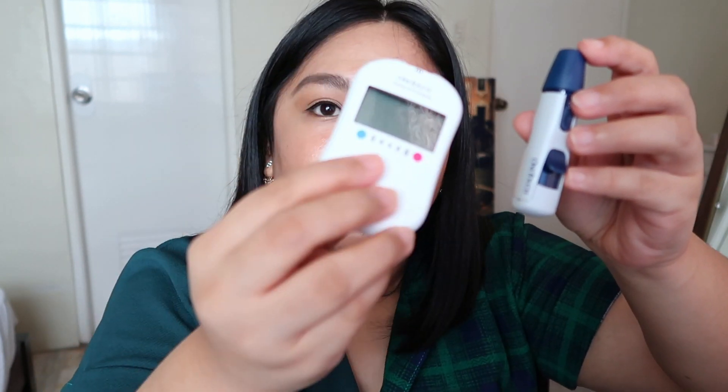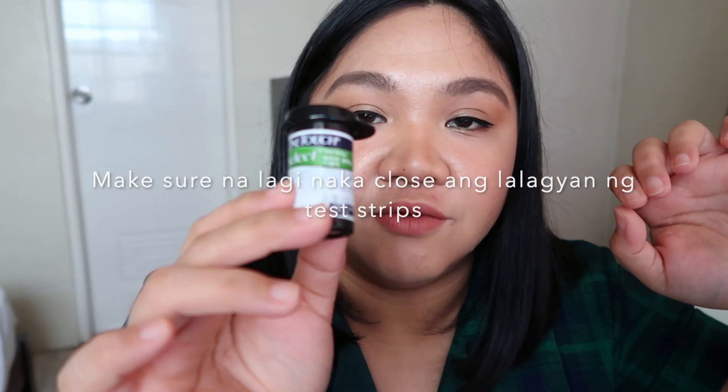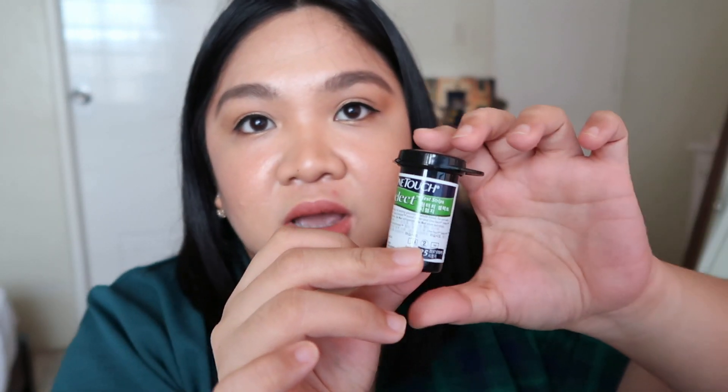This is the meter, and this is the lancing device. And this is the One Touch Select test strips — 25 pieces. This is what you need to buy every now and then. I bought it from Watson — it's in Mercury or any drugstore. This is about 600 pesos.